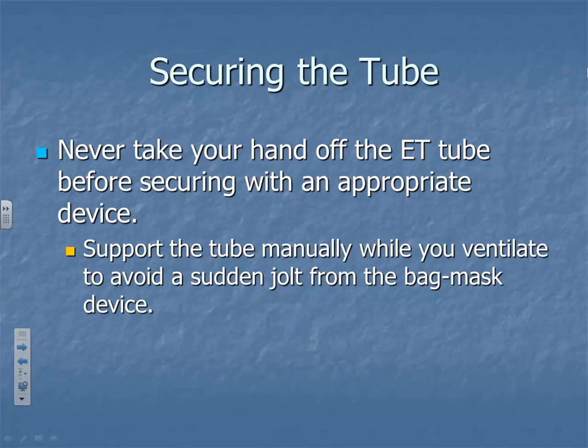As soon as you finish your intubation, you've auscultated, you know you're in the right place, you might even take a magic marker or a pen and make that mark. That's the mark at the teeth. If you look down there and that's moved, you've dislodged your tube. It happens very frequently. So I like to put a mark right there, because my brain won't remember if it was 22, 22 and a half, whatever it was. So I'm usually going to mark it and then secure it.